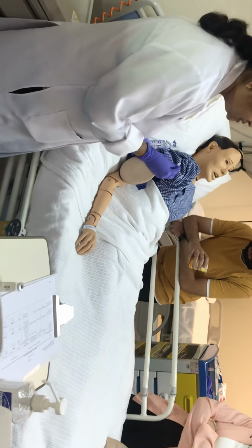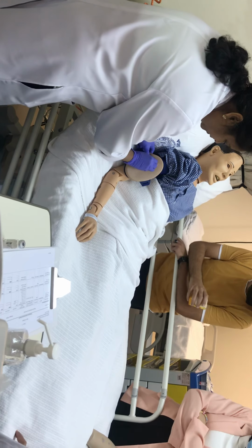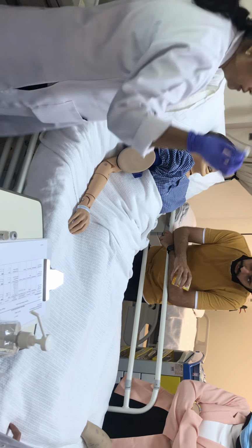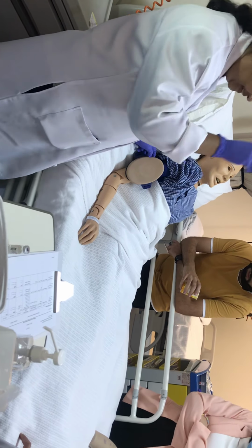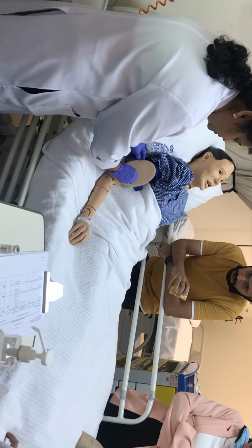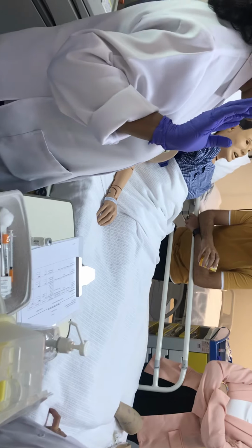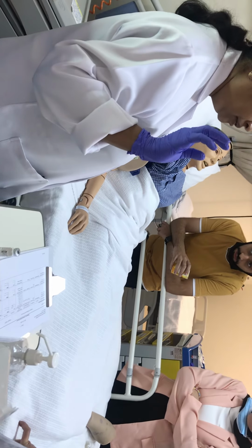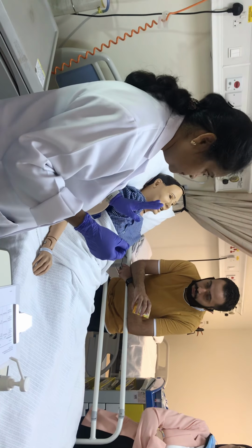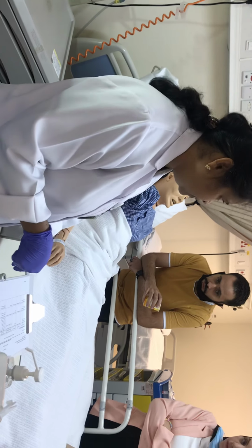Okay, I need to clean the site in a circular motion from inner to outer. Just go at least 2 centimeter or 5 centimeter around the wound. Not the wound, the side. This side. So just once from the middle, go round once. That's all. Okay, now let it dry, because whenever alcohol is there, if we are going to give injection, they say it stimulates bleeding. So we are not going to do it now, let it dry. By then we will get ready.